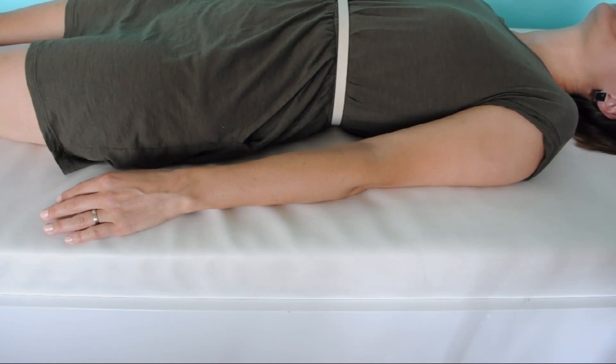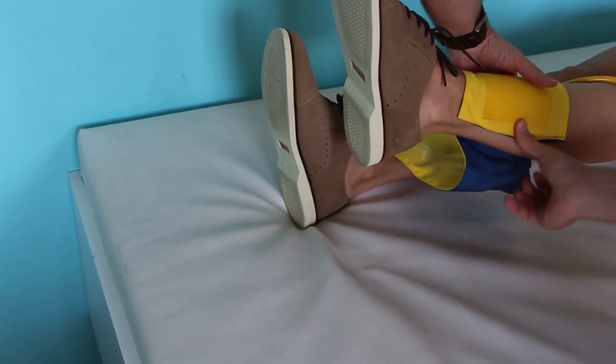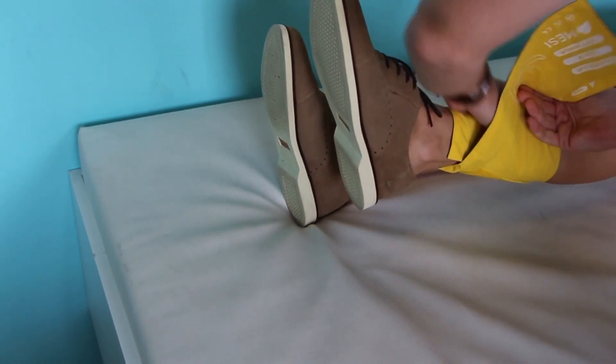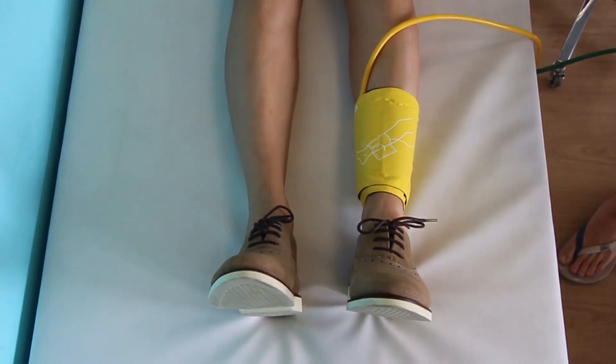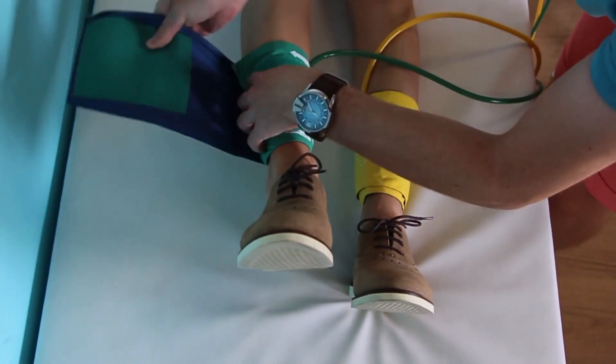Place the yellow cuff on the left ankle, considering the arrow indicator. Leg cuffs have to be placed so that they are aligned with the medial ankle. Place the green cuff on the right ankle, again considering the medial ankle.